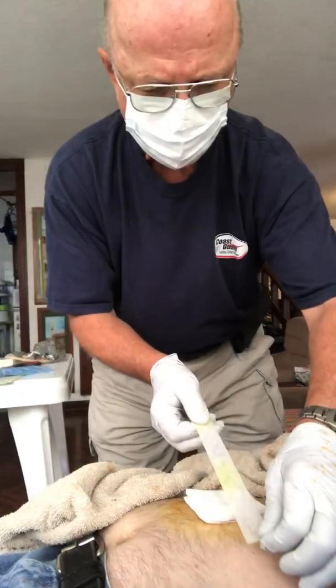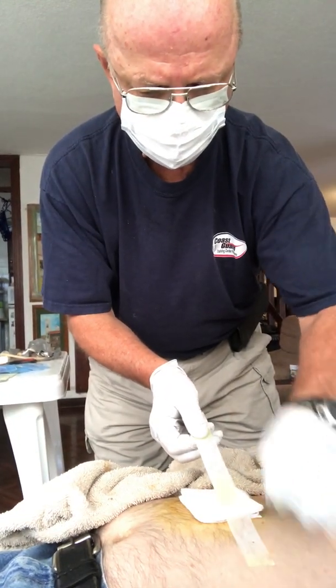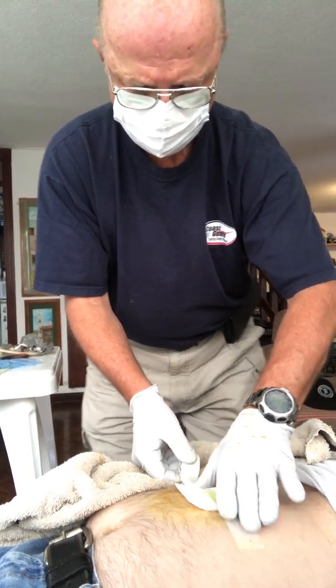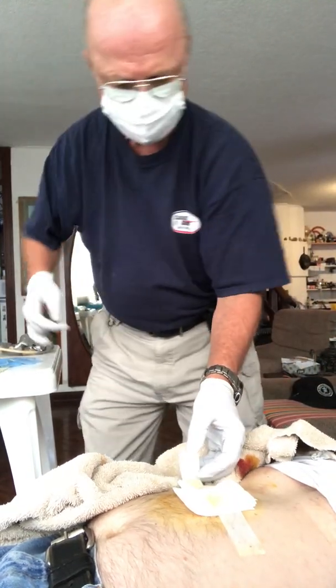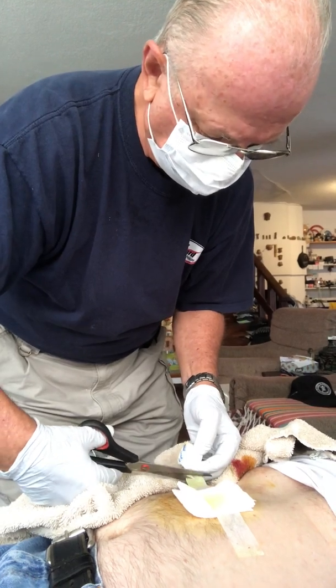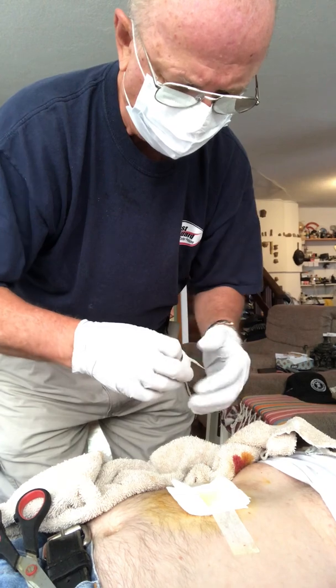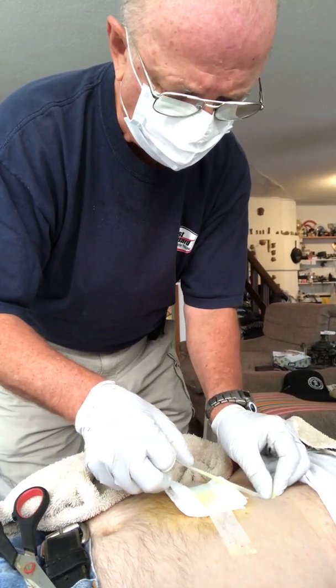So I'm going to. All that yellow stuff is just the betadine, okay? That's right.